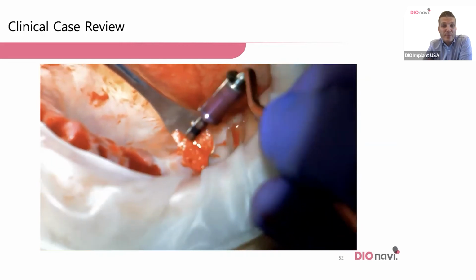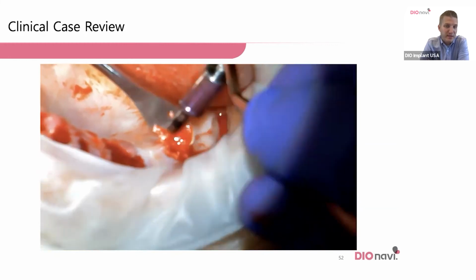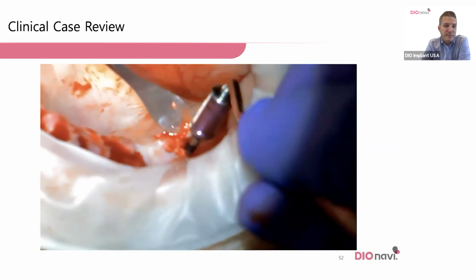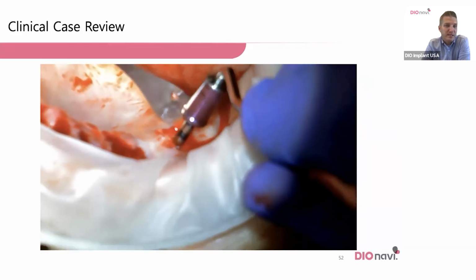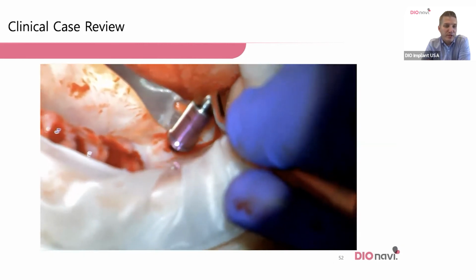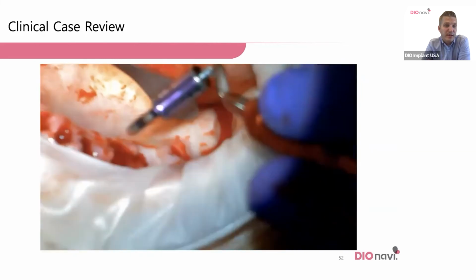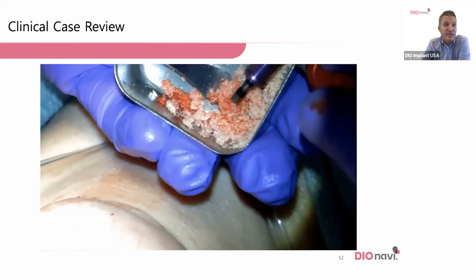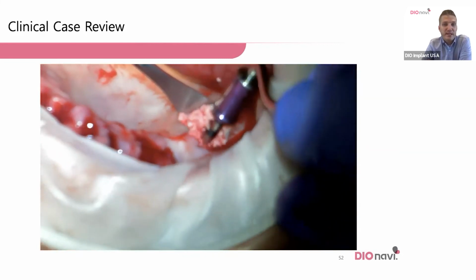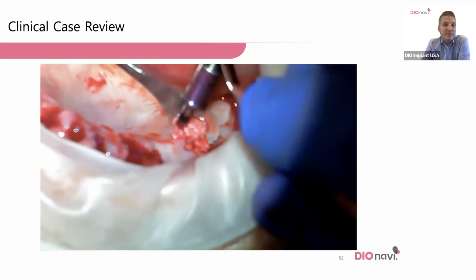But I'm going to pack the bone in, and I will say this step right here, although I think it looks kind of easy, it is where most clinicians stumble a little bit, and they make this harder than it needs to be. This opening is only 3.2 millimeters, which is a little bit smaller than what a lot of people are probably doing when they're doing crestal lifts. You typically are opening to your final diameter and then lifting. When you have an opening that's only 3.2 millimeters, packing the bone can sometimes get clogged.